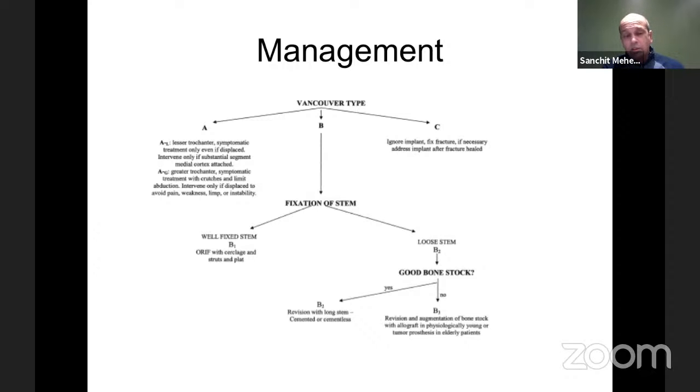A lot of the studies in the past have talked about strut grafts. We don't tend to use them nowadays, certainly in Bristol, partly because we don't have them on the shelf, and partly because they've been replaced with the modern locking plating systems.